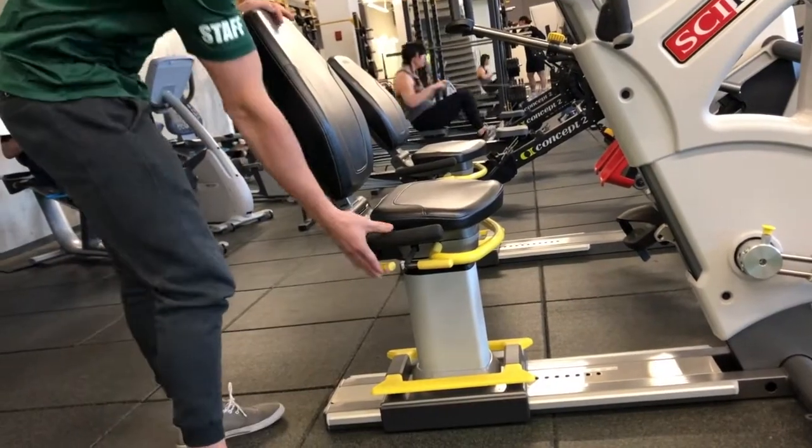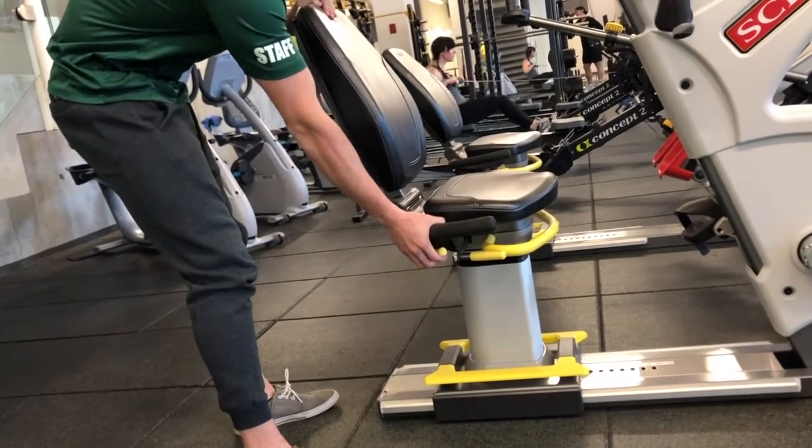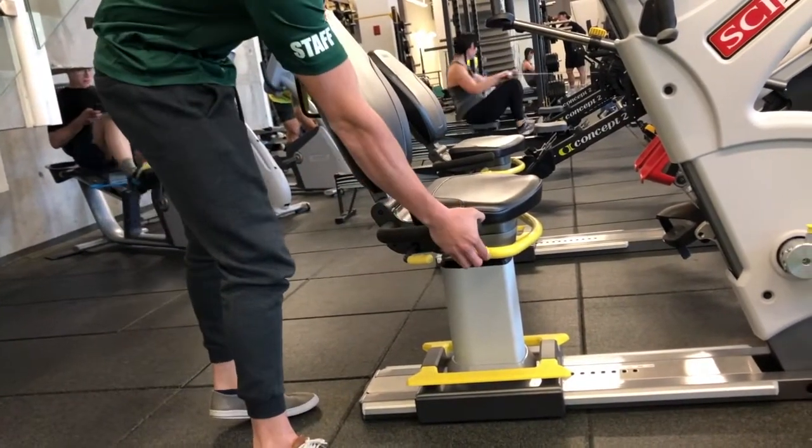The two latches on the side can be used to adjust the incline of the seat and to turn it outwards to allow for easy transfer onto the chair.